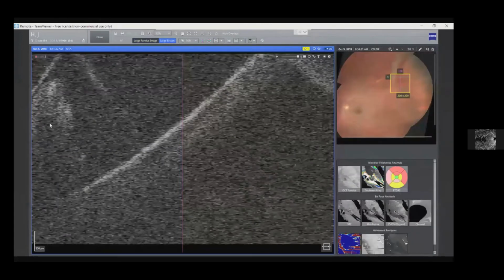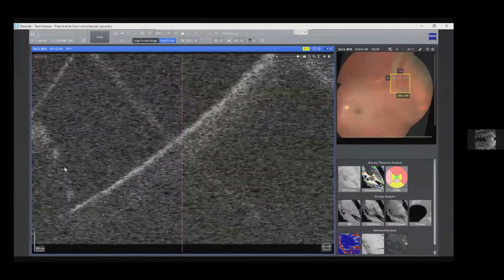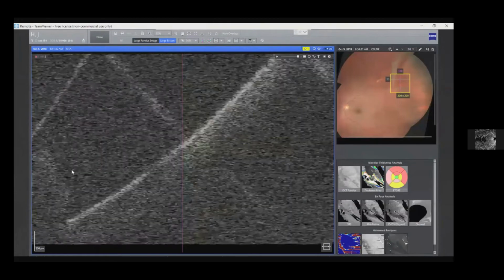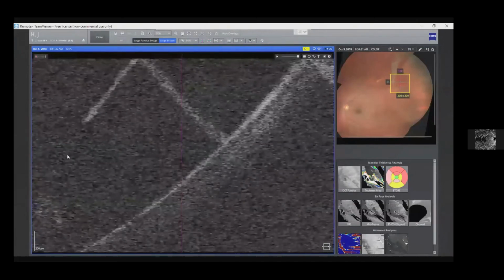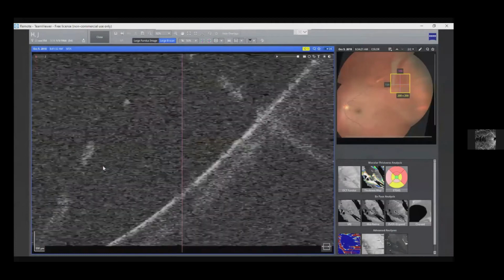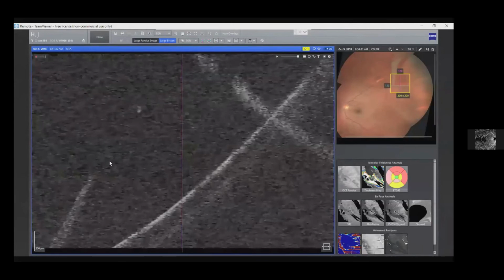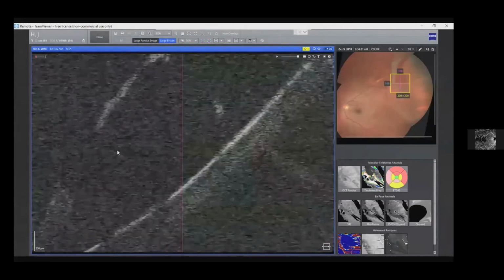So again, we're seeing at the apex here of this lesion, it's this scrolled outer retinal tissue, but here's your inner leaflet, the schisis leaflet, which looks pretty much intact. But as you scroll inferiorly, you start to see, oops, there's a defect there, and now there's going to be another defect here. So this is actually a patient who has a schisis detachment because they have breaks in the inner leaflet as well as a large outer retinal break. And so this patient actually needed surgery, but you confirm this with the imaging, and again, the correlation of the fundus photograph and the OCT B scan is very, very helpful.